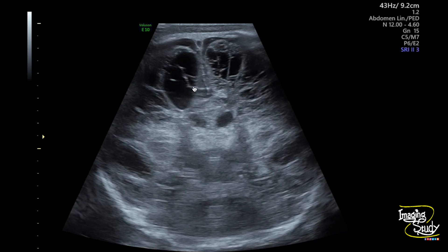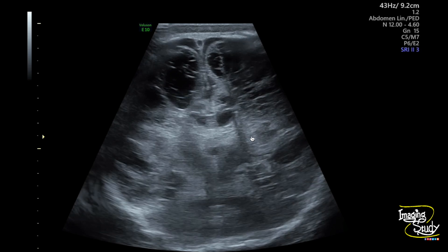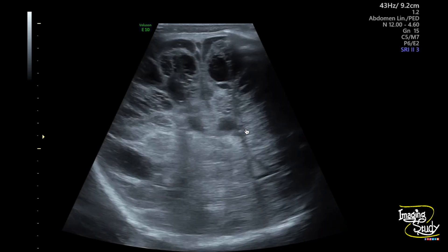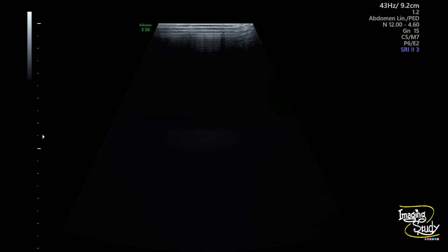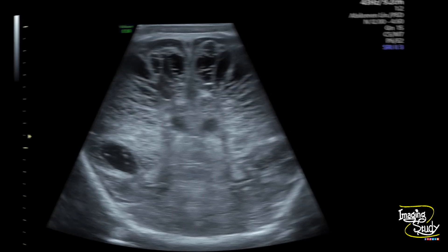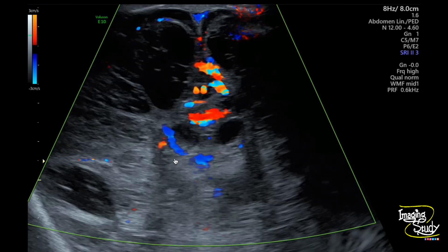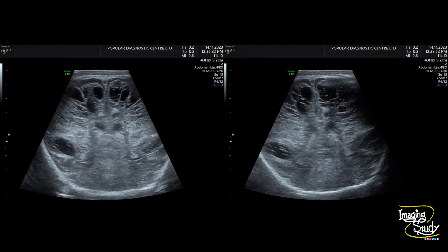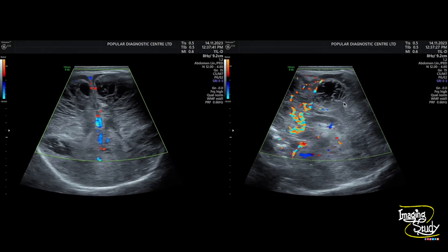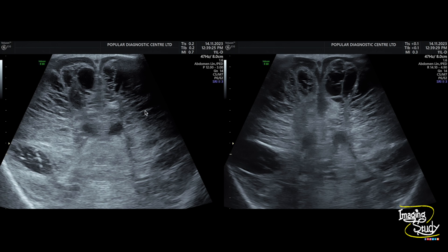Let's see with high frequency — these cystic spaces are well visualized right now. You can also easily appreciate the increased periventricular echogenicity here. We have put color Doppler here and there is no apparent vascular abnormality seen. Here you can see the coronal sections showing periventricular leukomalacia, and sagittal and coronal sections with color Doppler. You can see the anterior cerebral artery here. The corpus callosum is present. Again, another picture with high frequency showing the diffused cystic spaces with periventricular increased echogenicity.